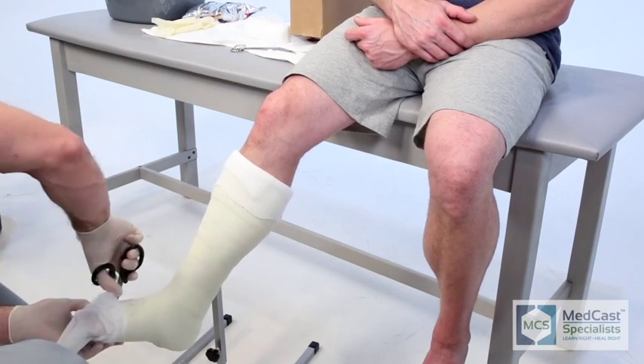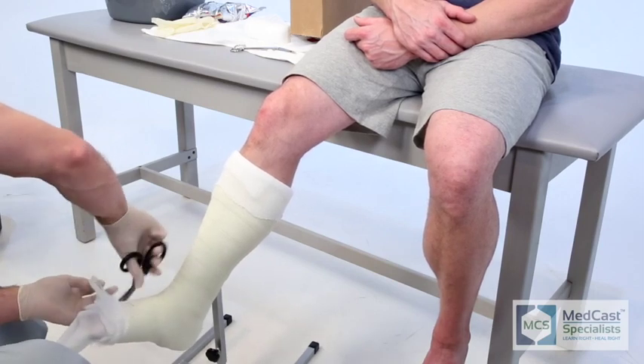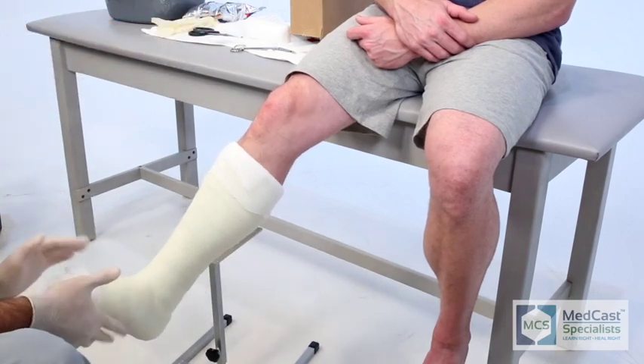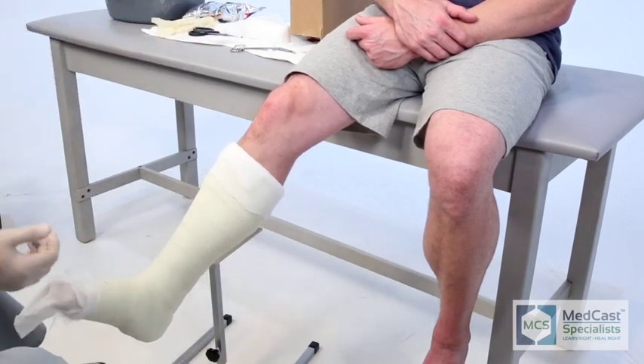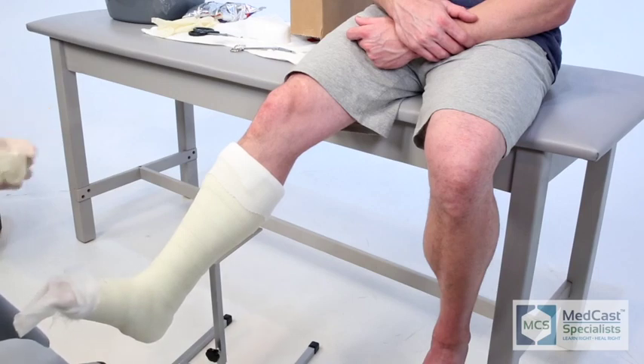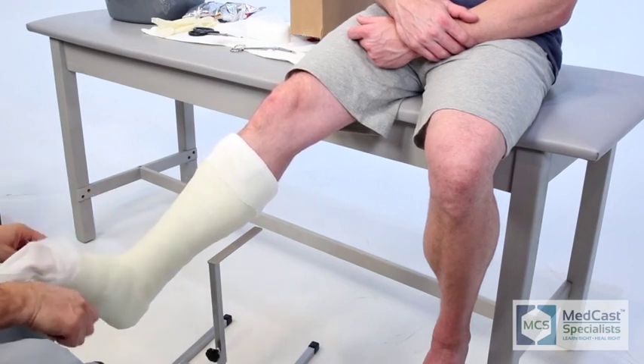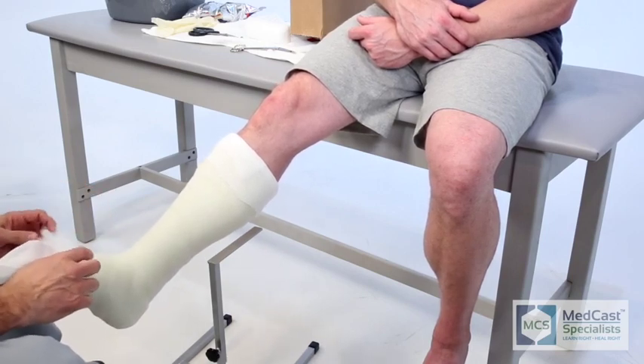At this point, if there are any areas of concern on the first layer of cast material, you can trim it back fairly easily, as you can see Lance doing here. Generally I like to keep the thinner portion of the cast extended out to the metatarsal heads and then cut back on the superior part so you have good toe flexion and range of motion.